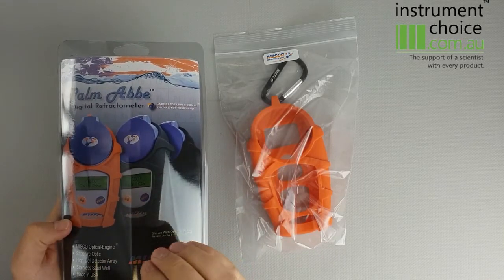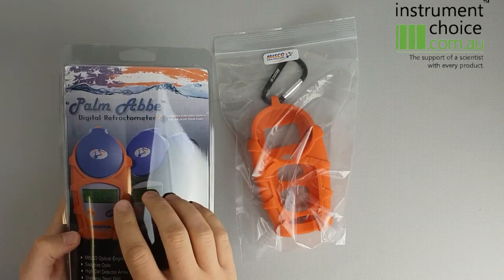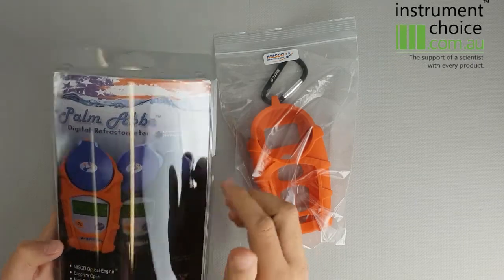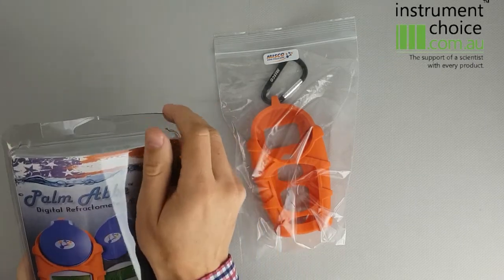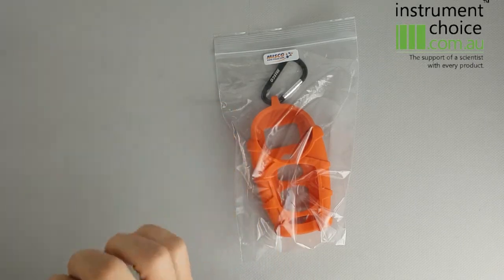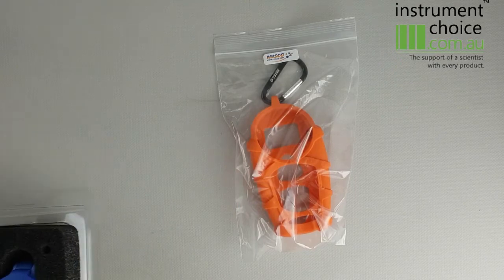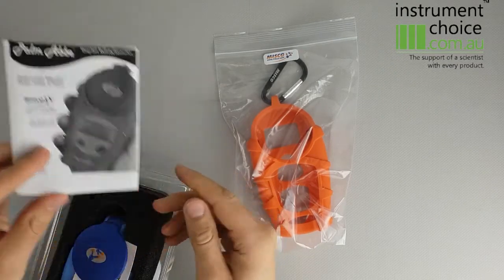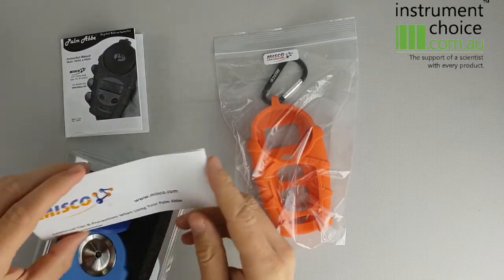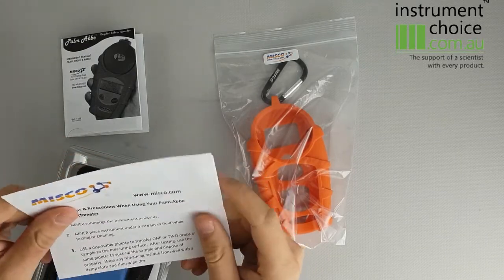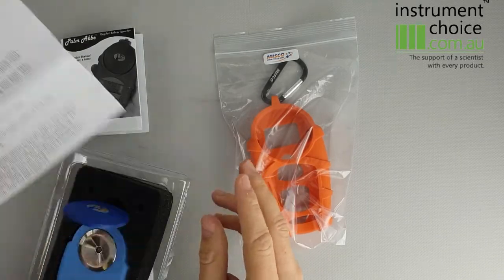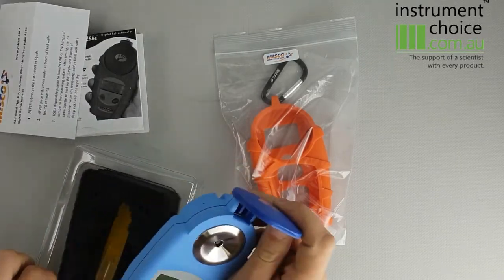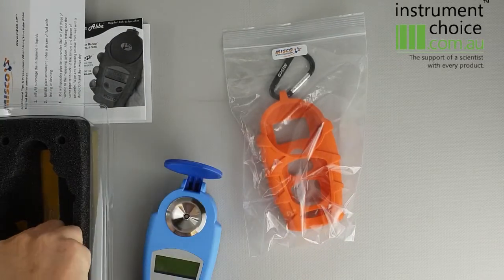It comes with a sapphire optic prism and also has a stainless steel well. As you can see when you open it, it comes packed with the manual itself, a few tips and tricks about using the meter itself, and then the meter and a few little pipettes.